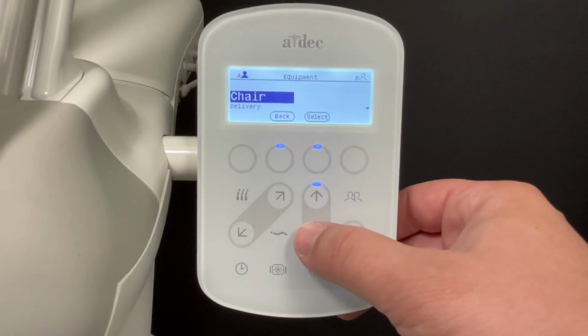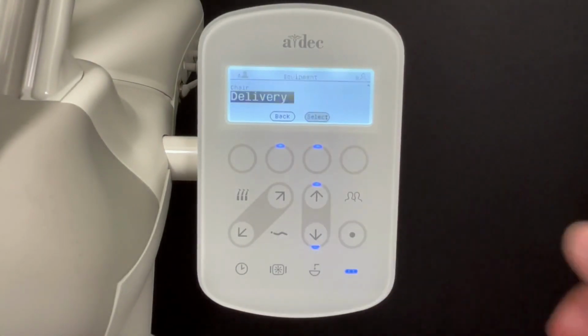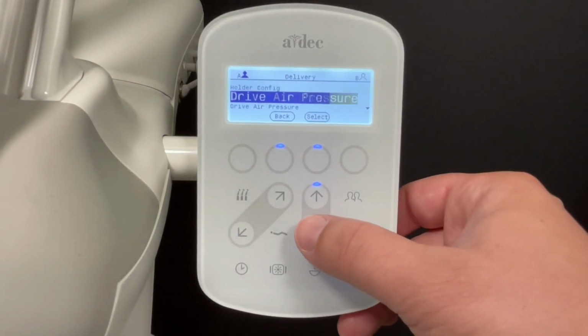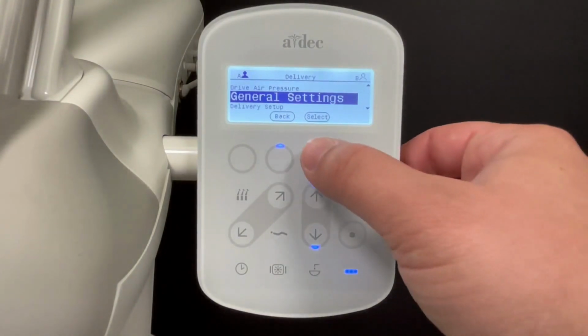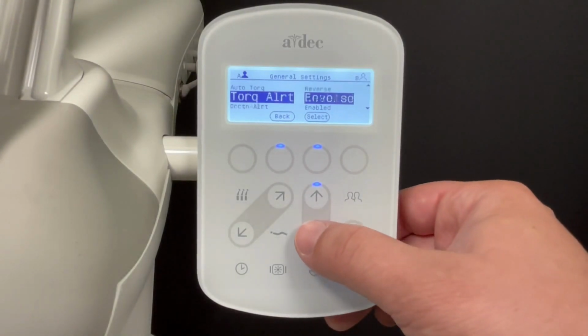Then to Delivery. Next, scroll down to General Settings. Then to Flush Alert.